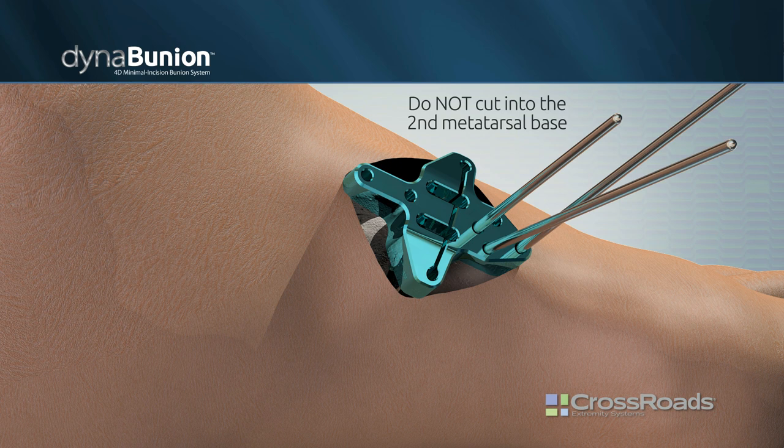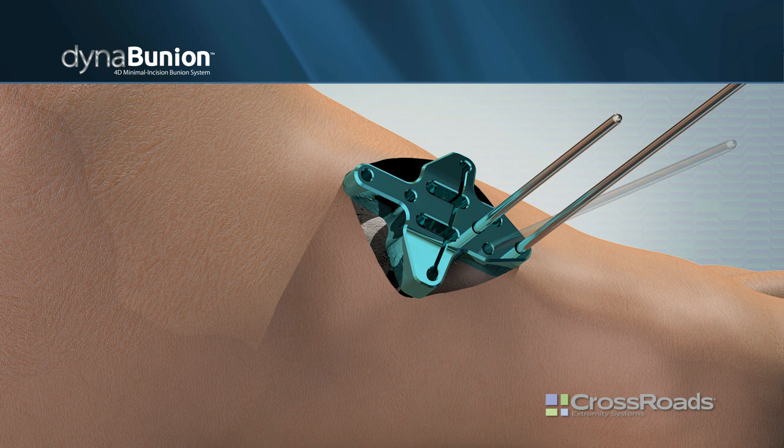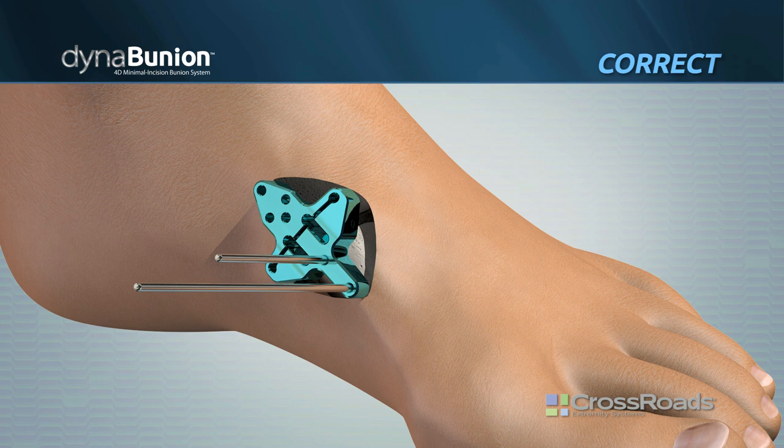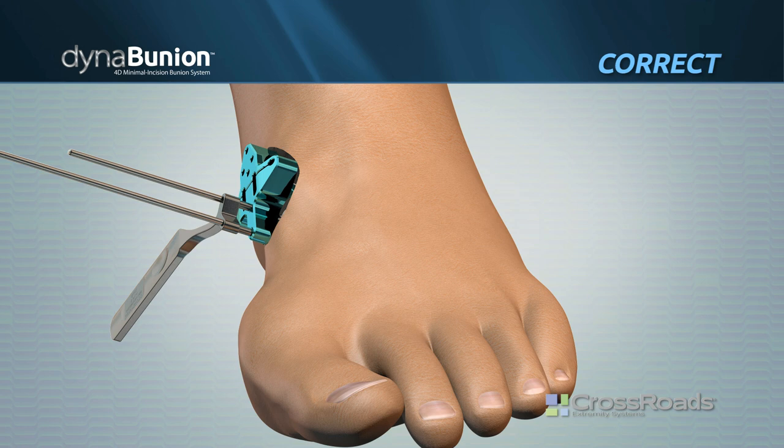Once the metatarsal cut is complete, remove the cut guide from the 2 mm wires in order to remove the bone sliver. Flip the cut guide around 180 degrees and place it back into the joint and over the existing wires. Place the frontal plane joystick over the two distal wires with the handle facing in either direction.